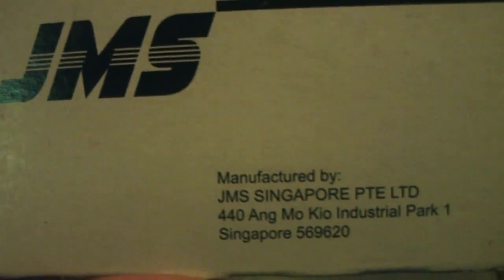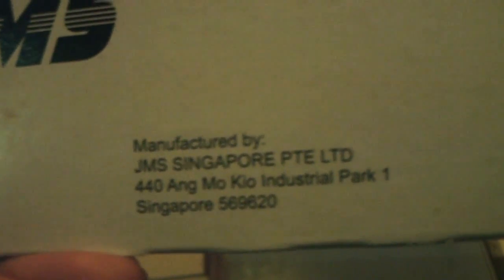Here's the butterfly needle box — I can show you the measurements. The manufacturer is Ang Mo Kio Industrial Park, Singapore brand, Singapore manufactured. And here's the Desferal box — I kept the box but there's no Desferal inside anymore, it's all empty.